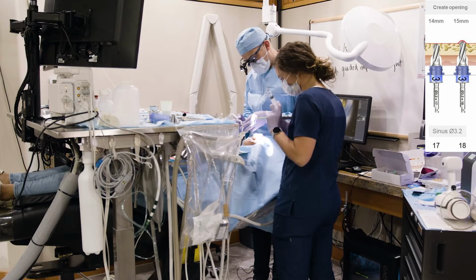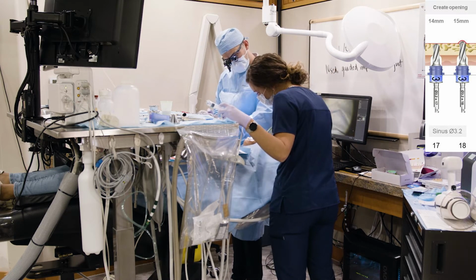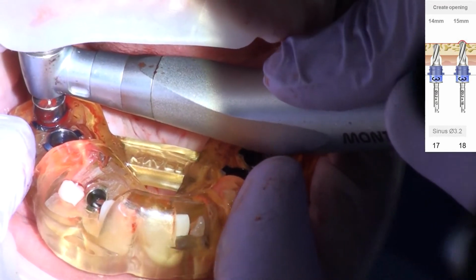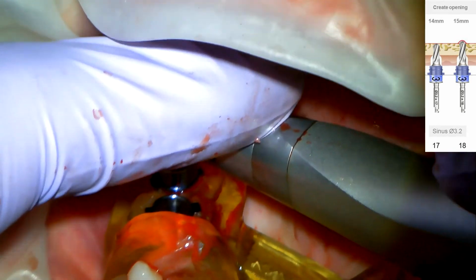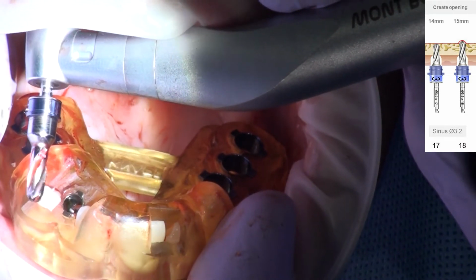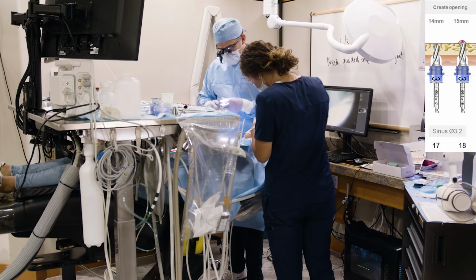These never change. Next step is the sinus pusher with 18 millimeter length, again with the 3 stopper. So this is essentially going 1 millimeter more. This is the drill that is going to be pushing just barely into the sinus. Real big. Only a millimeter here, really firm pressure. Beautiful. I always like to see a little bone at the apex. I'm seeing just a little there. Not there, but right there. I like that. She's going to push her water not too deep because the sinus is technically open now.